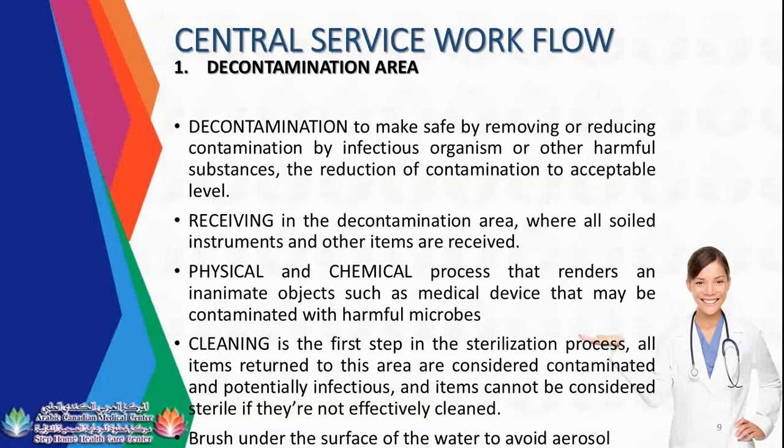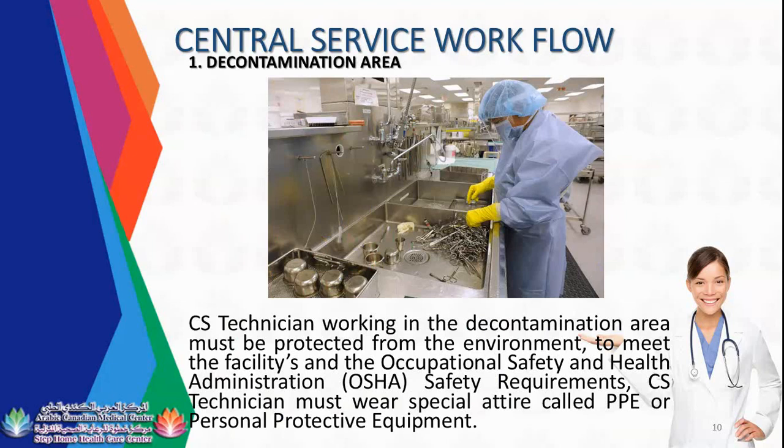So, as you can see in the picture, they have two sinks, but they still did not fill the first sink with water. But you need to fill the first sink with water so that once you brush the instruments, you will brush it under the surface of the water.